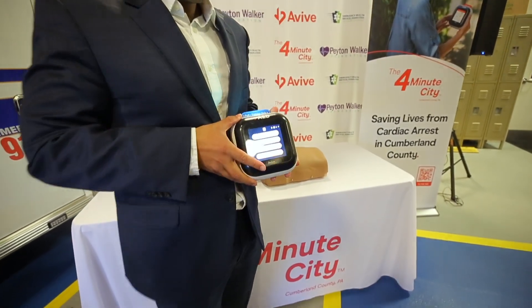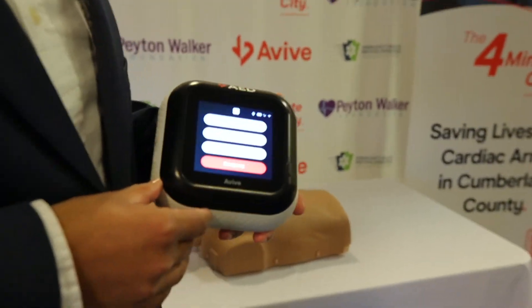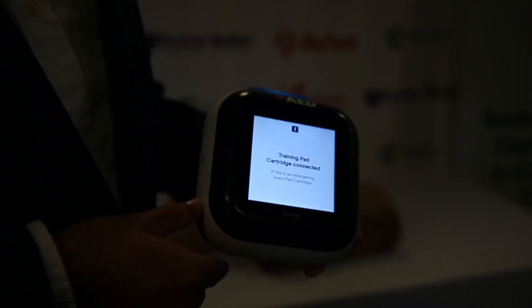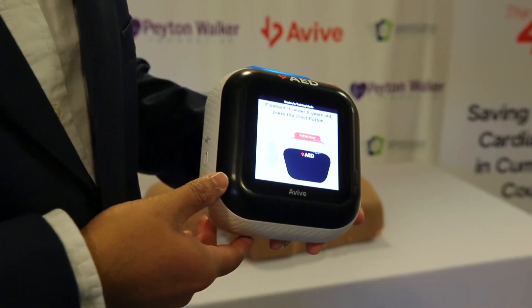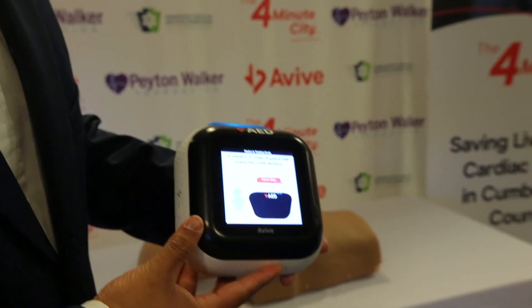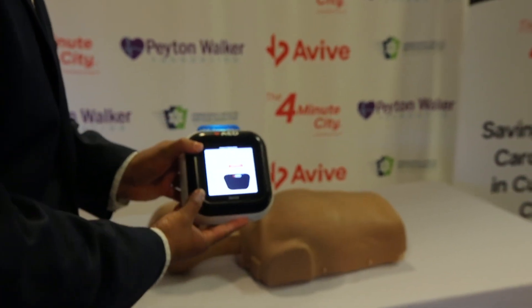Powered on. Training mode. If this is an emergency, remove the training cartridge and install the pad cartridge. If the patient is under eight years old, you must press the child button on the top of the device.